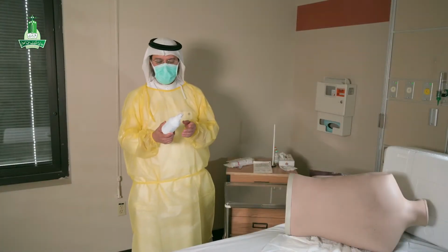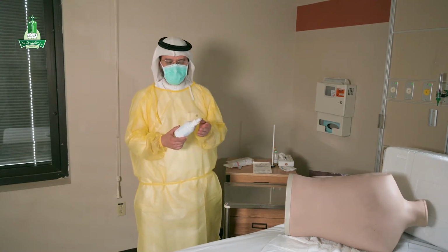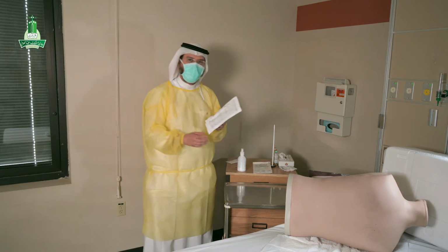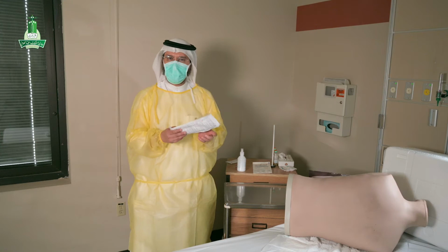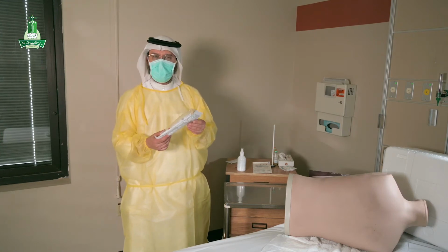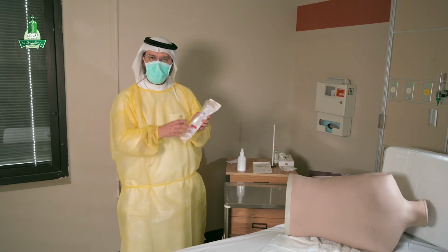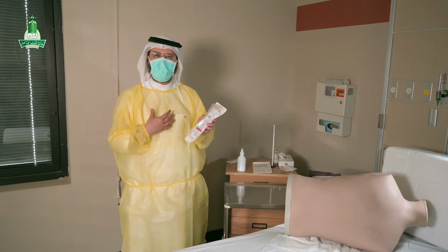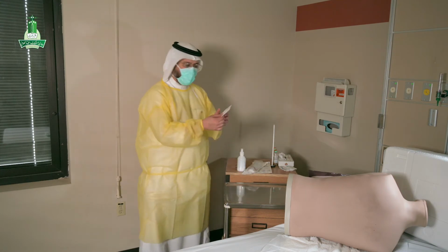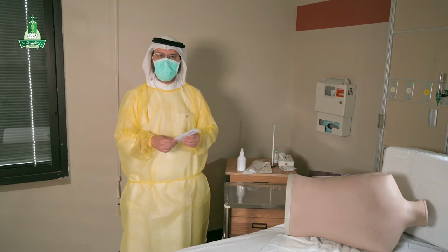We have two main skin disinfectants that you can use to prepare skin for procedures: povidone iodine, or chlorhexidine gluconate 2 to 4% mixed with isopropyl alcohol 70%. The chlorhexidine gluconate comes in different volumes and applicators. This one is a big applicator for big surgeries like coronary artery bypass surgery or laparotomy. And you have small packs like this one for, say, taking a blood culture or doing other small sterile procedures.